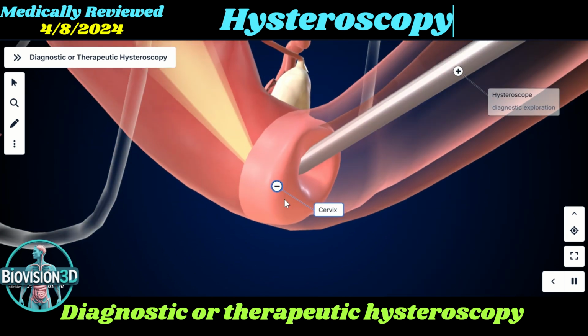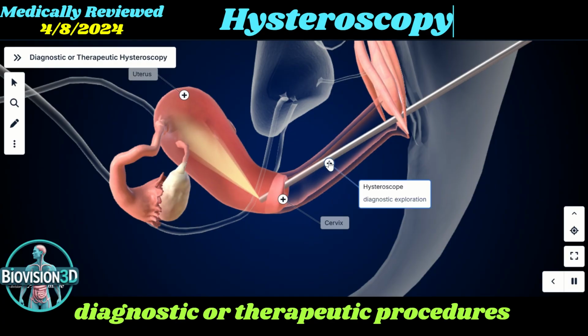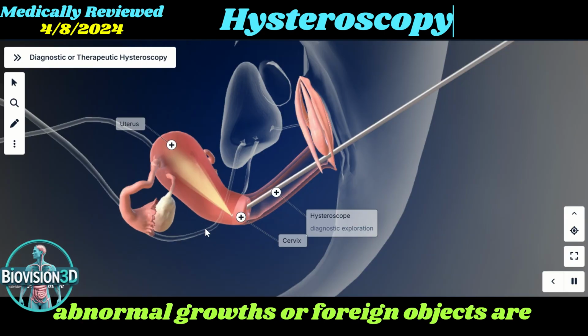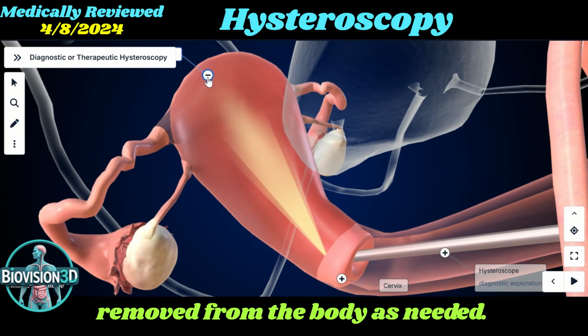Diagnostic or therapeutic hysteroscopy. The hysteroscope conducts the necessary diagnostic or therapeutic procedures while inside the uterus. Tissue samples, abnormal growths, or foreign objects are removed from the body as needed.